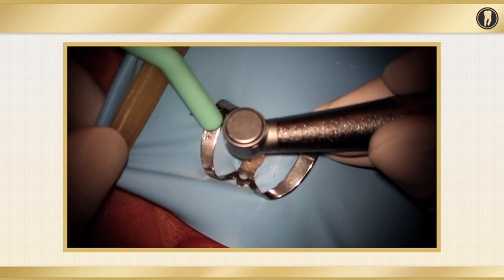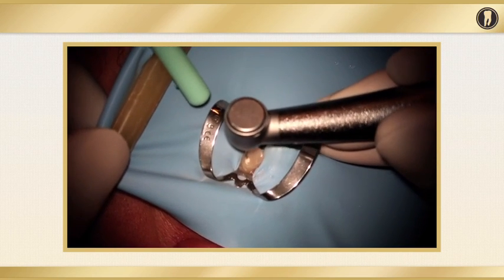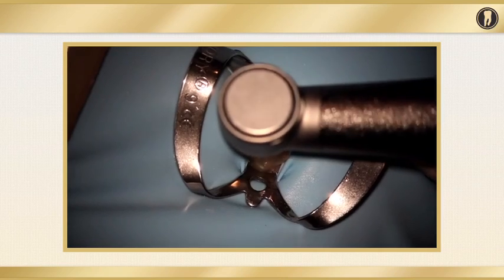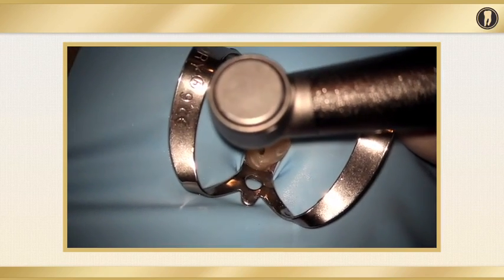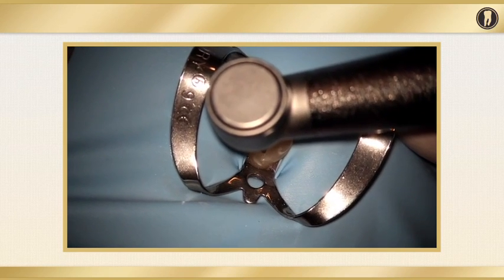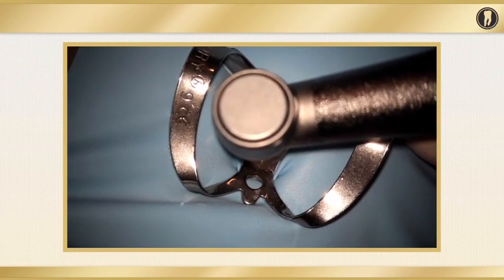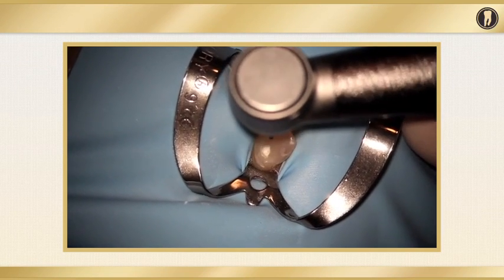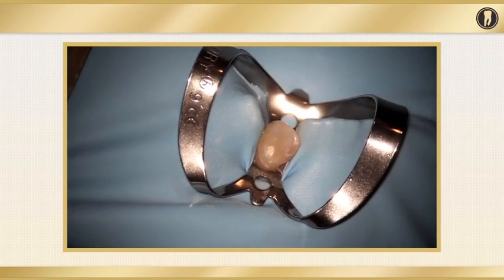You're making an angulation down towards the pulp chamber. Again, I recommend taking small bites and taking your time. I think this took me a couple of minutes to access the pulp chamber, because I wanted to make sure my angulation was right, especially when doing a facial access. But this case turned out just fine. I was able to get into the pulp chamber. Some of these cases are going to throw you a curveball, and you have to think about what you want to do. In this case, I did a facial access.